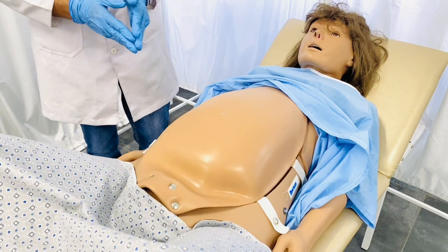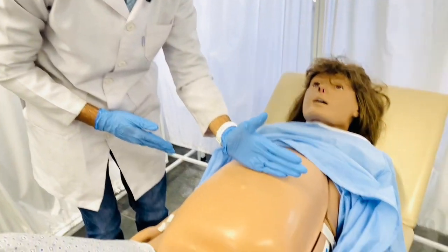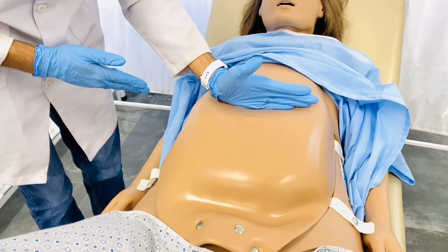To start the fetal auscultation, first of all you should know the position of the fetus. For that, we will start with the Leopold maneuvers. To start the Leopold maneuvers, we should know the fundal height of the uterus. To determine the fundal height, we can use the ulnar border of our left hand and palpate.